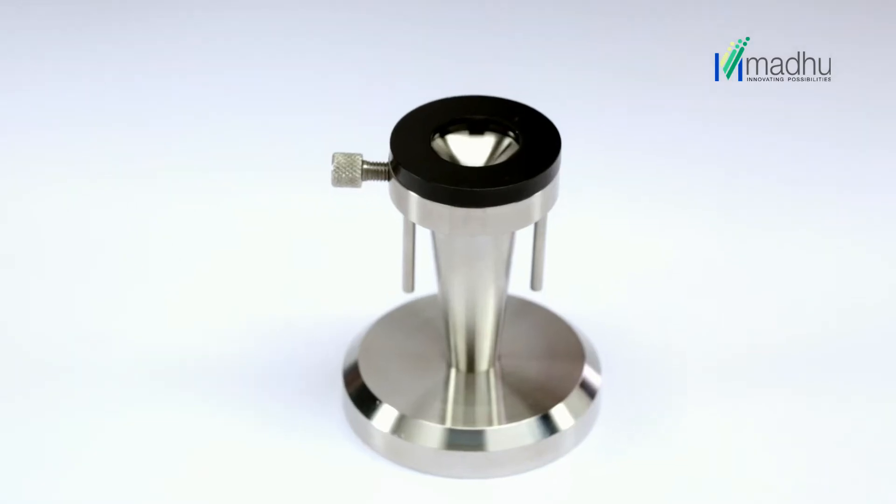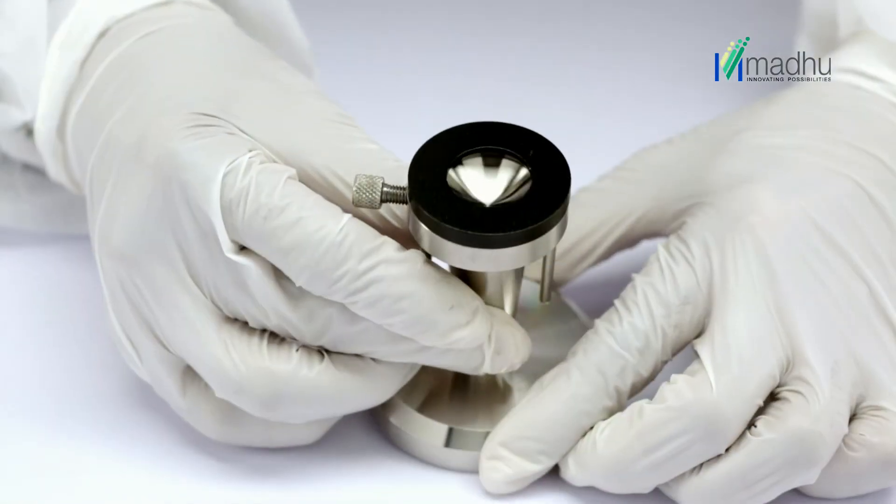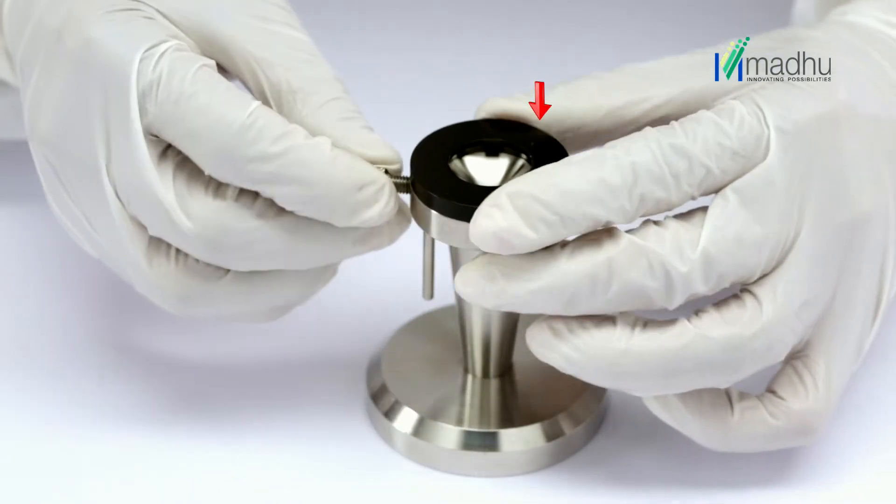An eyeball stand consists of a conical stand, top fixation ring, and a locking screw.